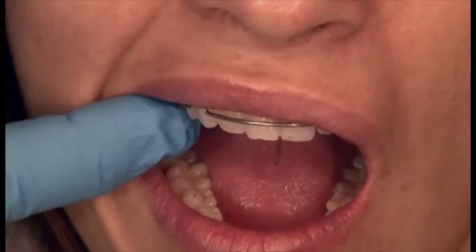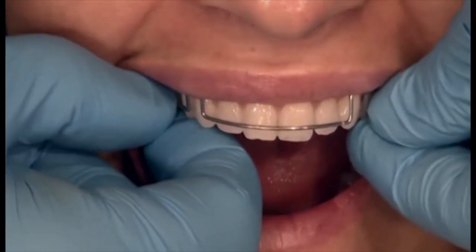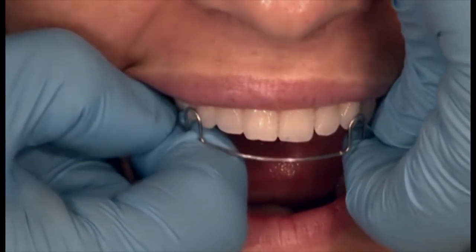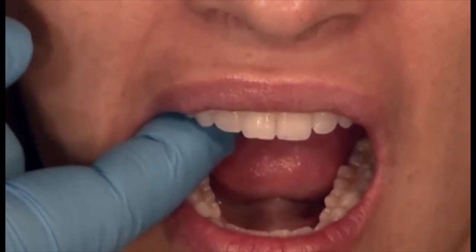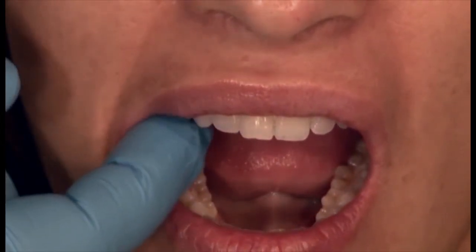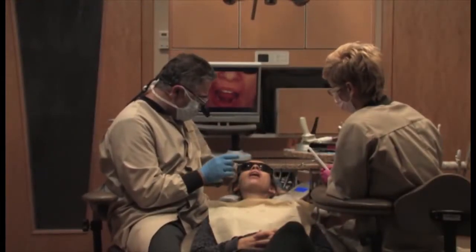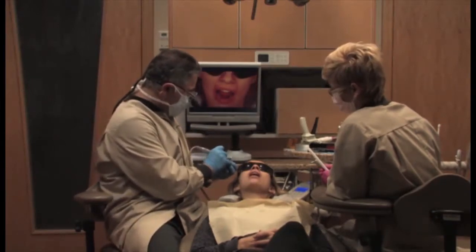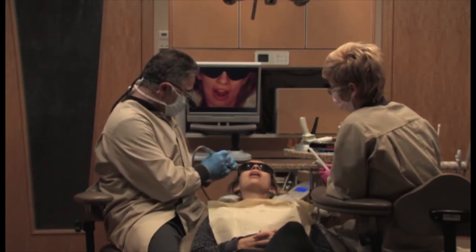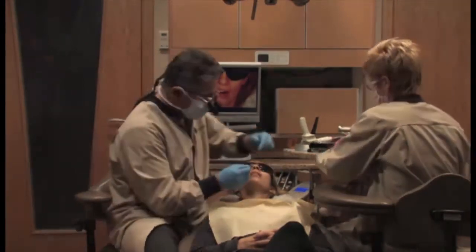Sometimes when you take the contact off the tooth and ask the patient to close on the deprogrammer, they'll say, oh, no, I still have contact in the back. And so as the jaw continues to seat and close, you still may pick up posterior contacts. Those must be completely removed until the patient comes back on to the deprogrammer. At this point, the deprogrammer will be relieved again, making sure that the spot stays as flat as possible to have absolutely no inclines.